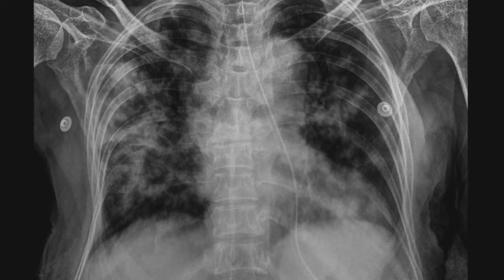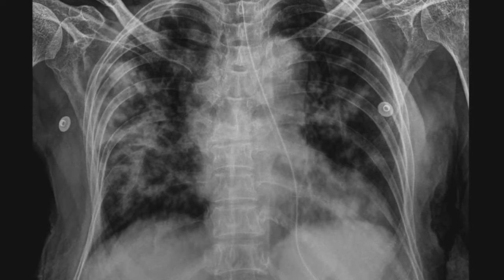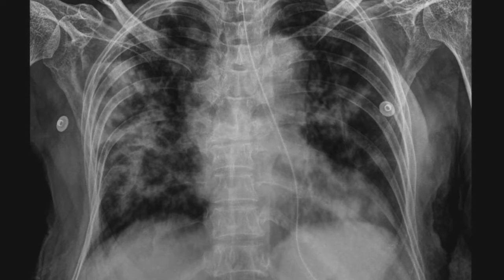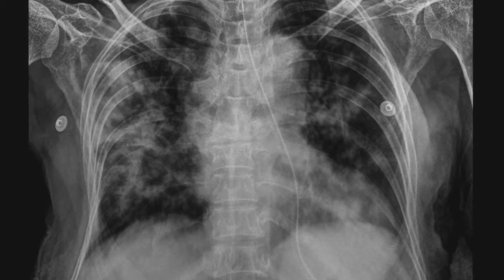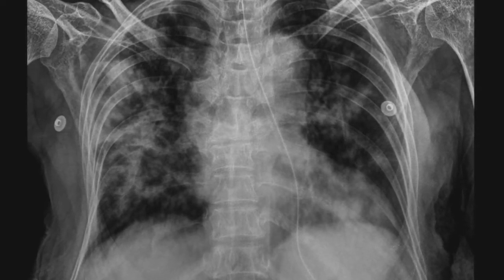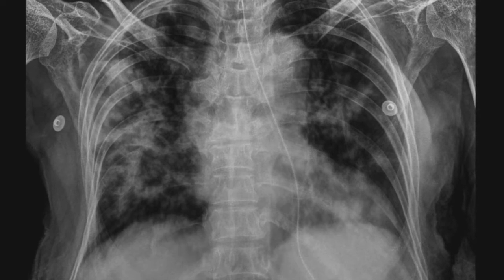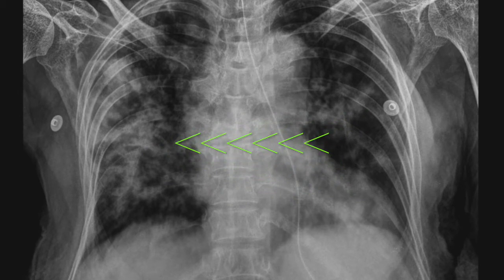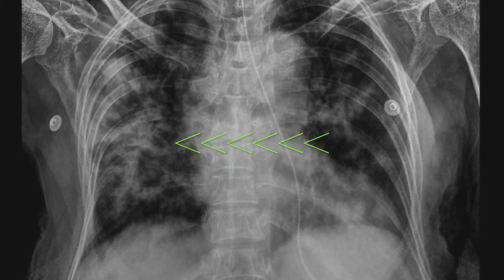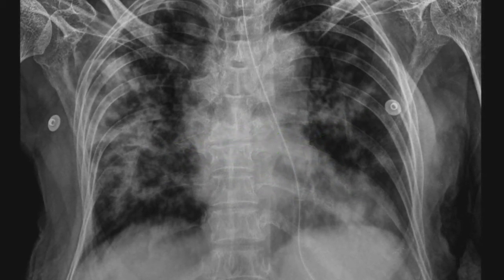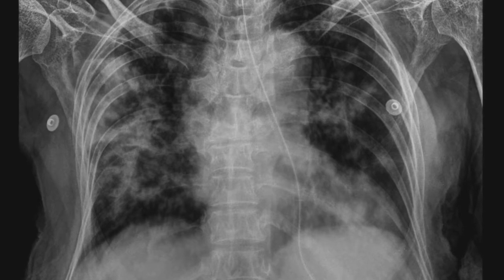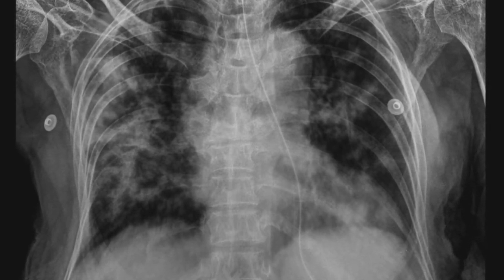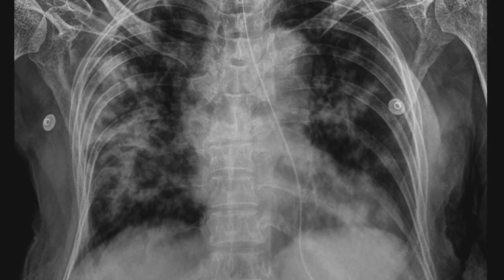As we can see on this X-ray, there are multiple patchy airspace consolidations seen in both mid zones. We can also see cavitations in the right mid and lower zone. What is also of interest is not just the lung — if we look closely at the dorsal spine, we can actually see a compressed or collapsed vertebral body at the mid dorsal level.